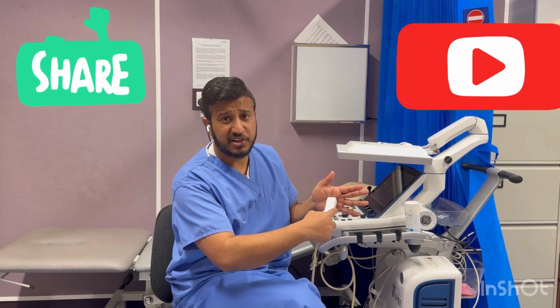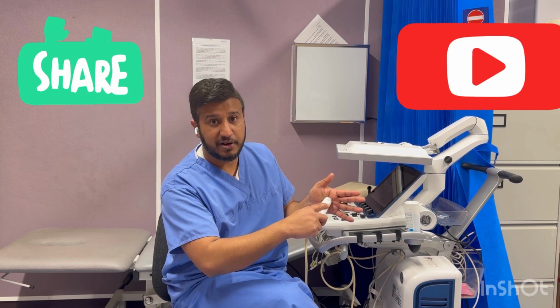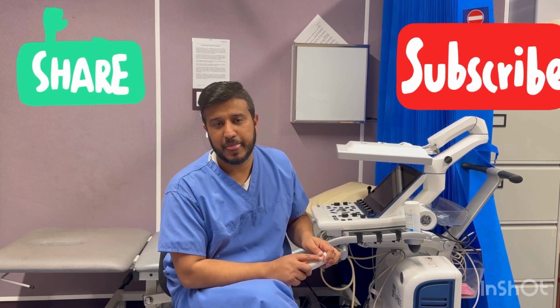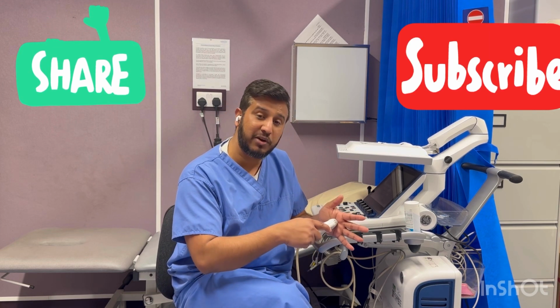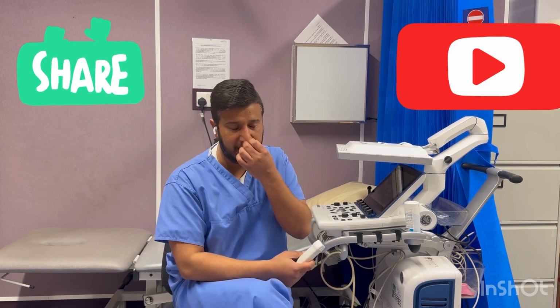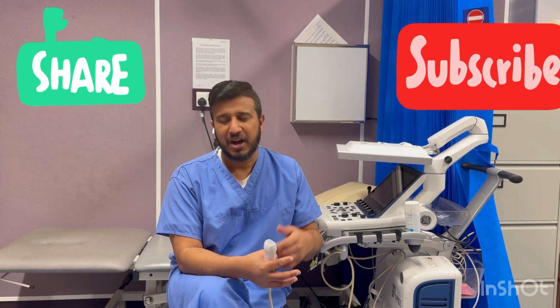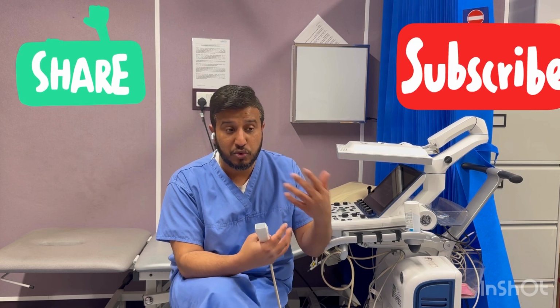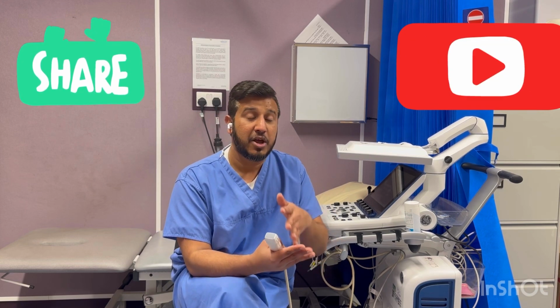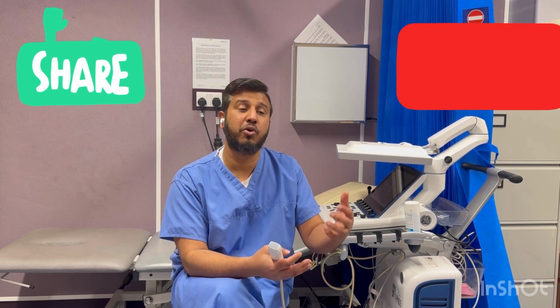Once you get the subcostal view, for example the four-chamber, then you rotate your marker slightly here. Once you are around 12 o'clock, you will see the IVC. Then once you rotate on the same point and tilt your tail up, you will see the abdominal aorta. You will learn these things when you are doing the echo. I think explaining this would not be very helpful, but if you are doing it and still struggling to get any of these, for example the abdominal aorta, let me know, so I'll give you more tricks on the patient.